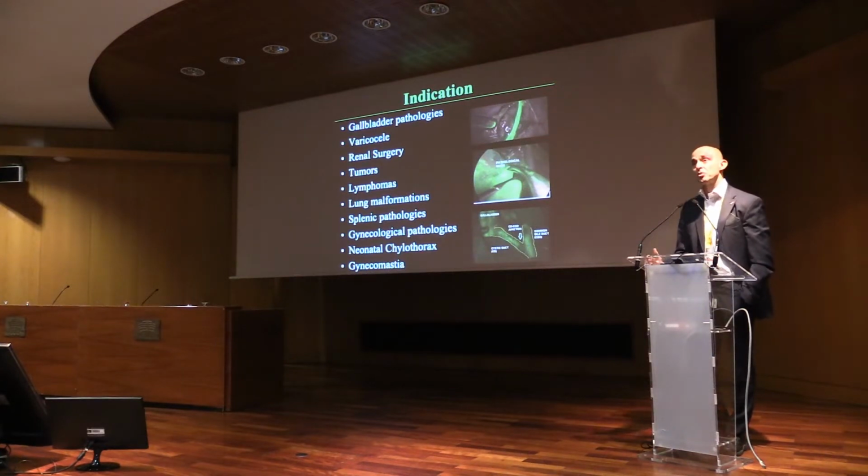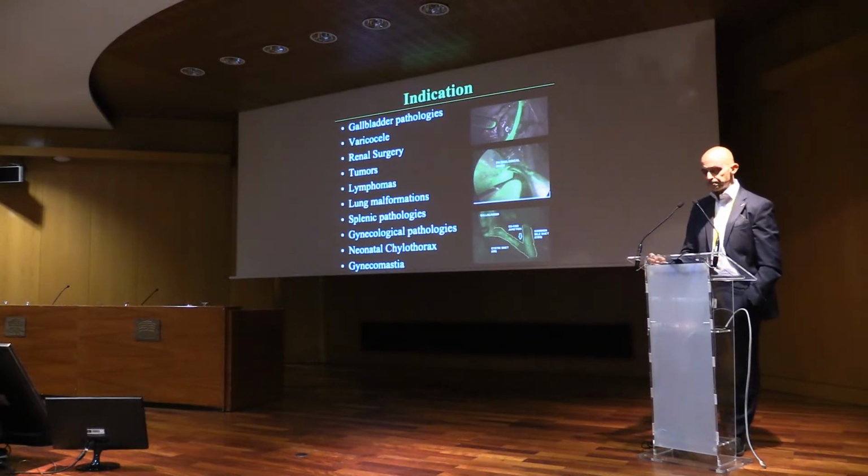The main indication is probably gallbladder pathology, above all cholecystectomy. There are some reports in the adult literature over the last 15 years. We started to adopt this technology in pediatric surgery 6 years ago, and other indications are varicocele, renal surgery and tumors, but you can see there are a lot of indications that you can have.